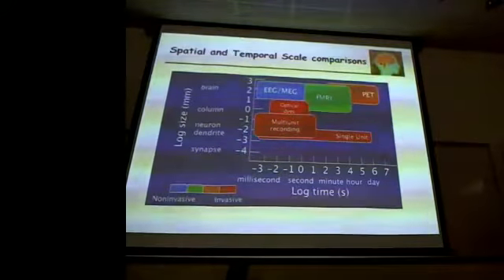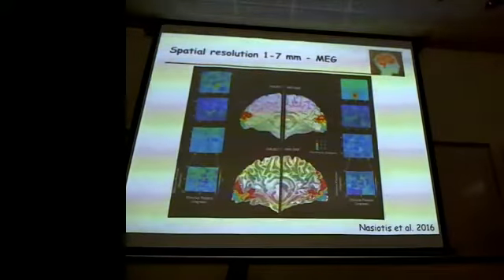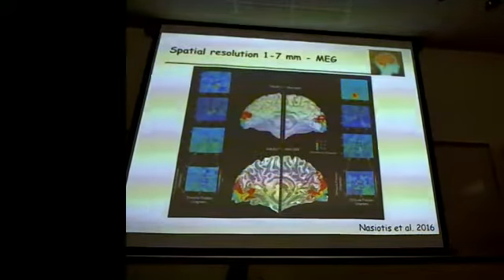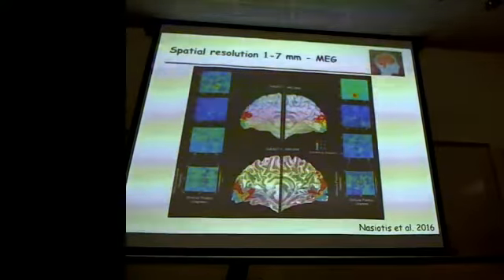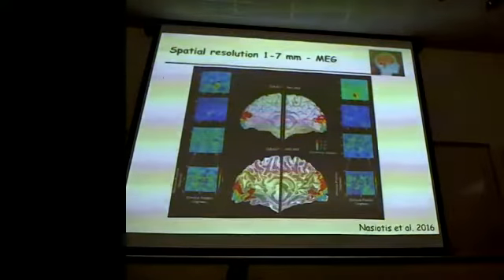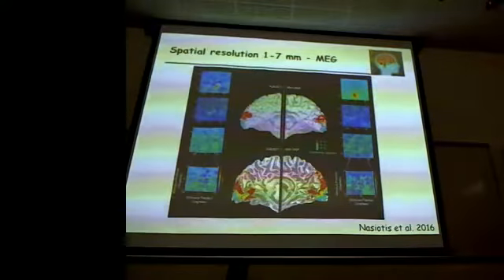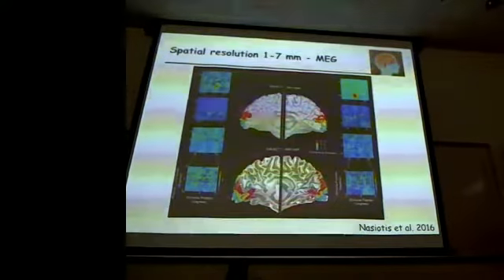So I'm going to argue this point a little bit with the slide with some recent results. This is a study that just came out of the group in Canada, run by Sylvain Baillet, and he's been involved with MEG research for a long time. They did a retinotopic study, so if you present visual stimuli in different parts of the visual field, then you can create a retinotopic map on the visual cortex. And so this top map is the results from MEG, and this bottom map are the results from fMRI.